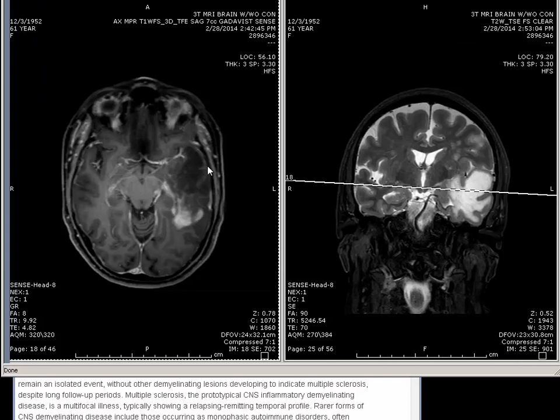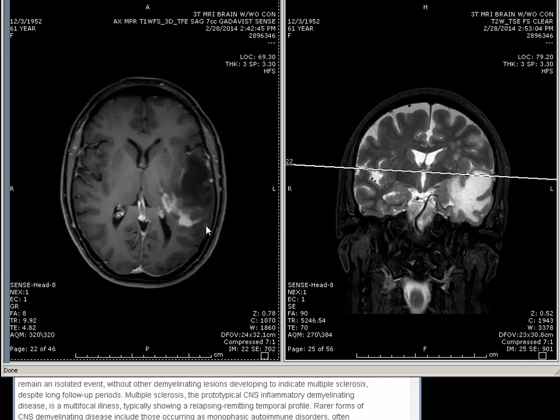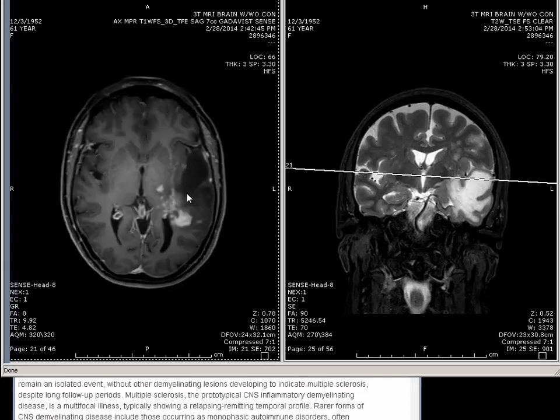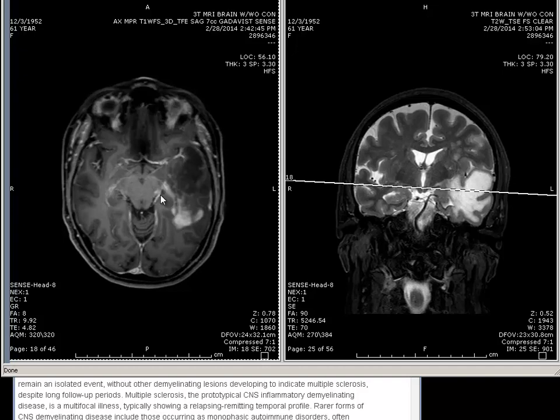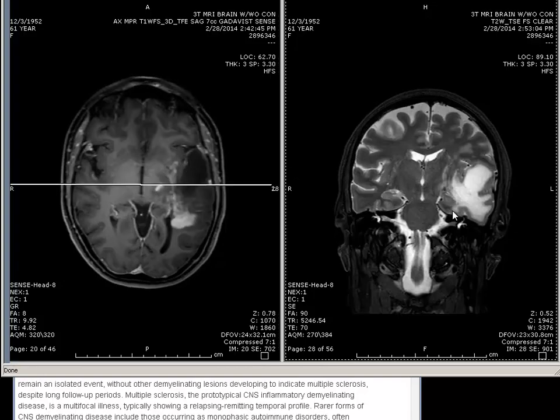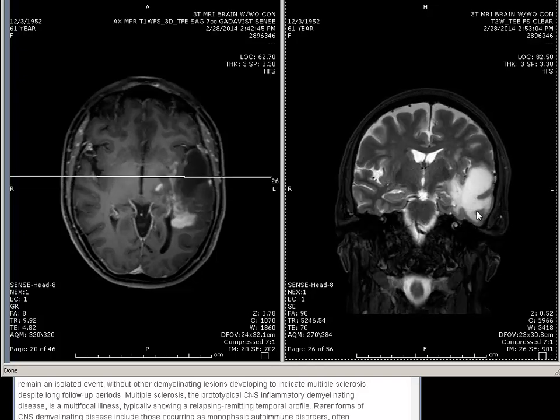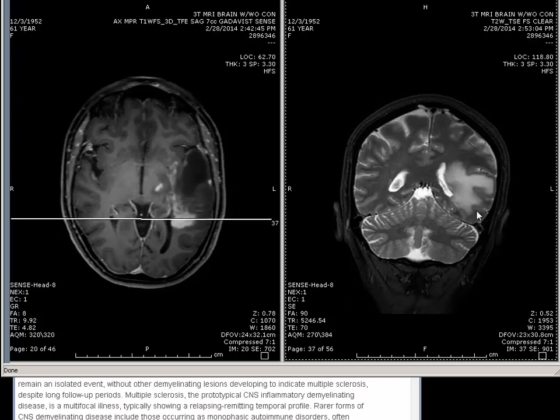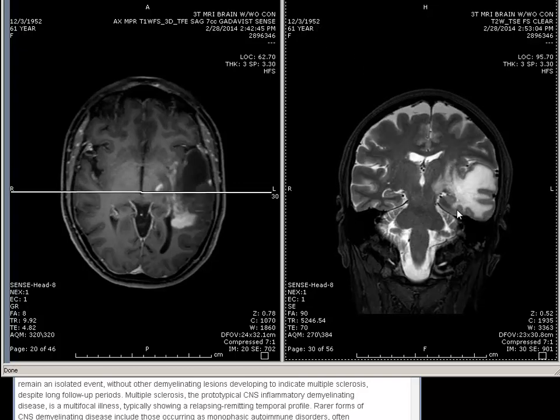findings first. So basically, the patient has a large left side temporal lobe lesion with heterogeneous contrast enhancement, some part of it even tracking along the left side corticospinal tract. That's the size, and part of it enhanced, part of it doesn't enhance. These are the coronal images, and there's some 3 millimeter midline shift. So I suspect a primary brain tumor in this patient, like a 61-year-old.